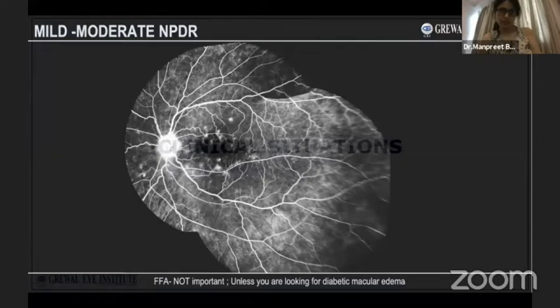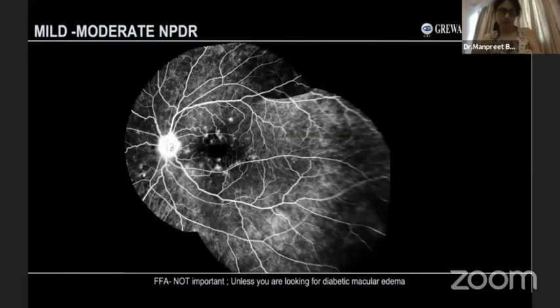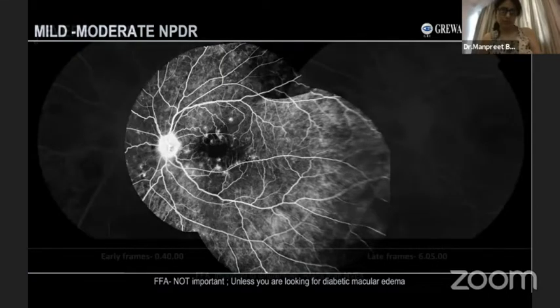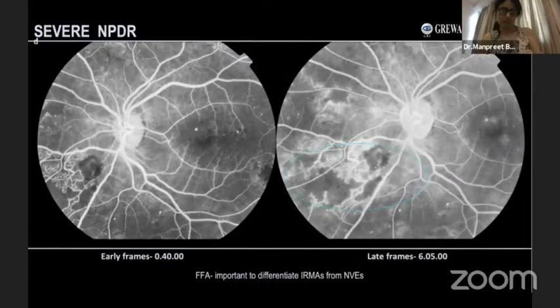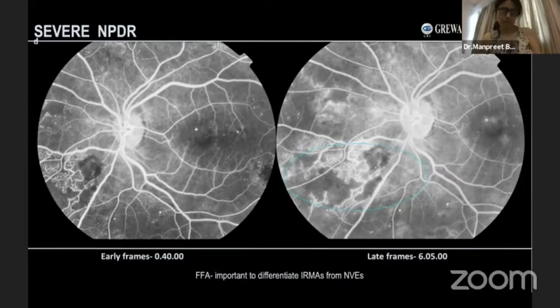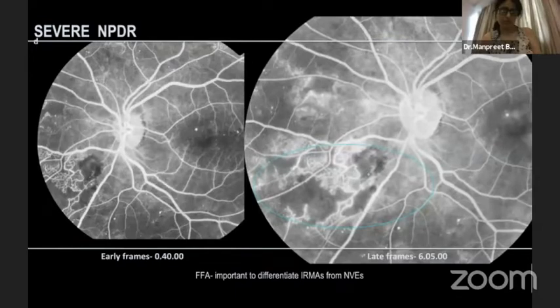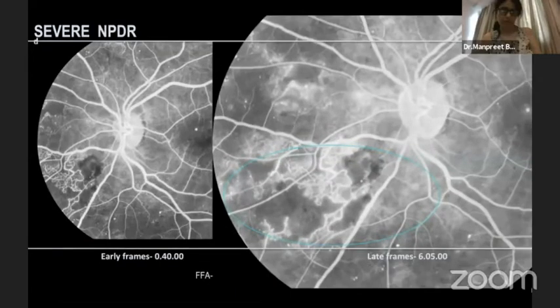In case of mild to moderate NPDR, you don't need an angiogram unless there is an associated DME and you want to know the details. FFA in mild to moderate NPDR is not indicated. In case of severe NPDR, at times it helps you to differentiate it from early PDR. The early frame of fluorescein angiography here depicts an intra-retinal microvascular abnormality seen in the nasal retina, which clearly does not leak in the late phase, thus ruling out NVE.